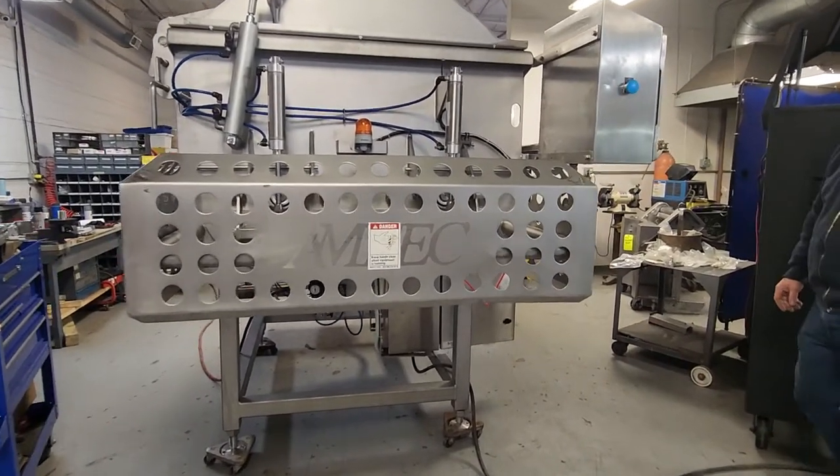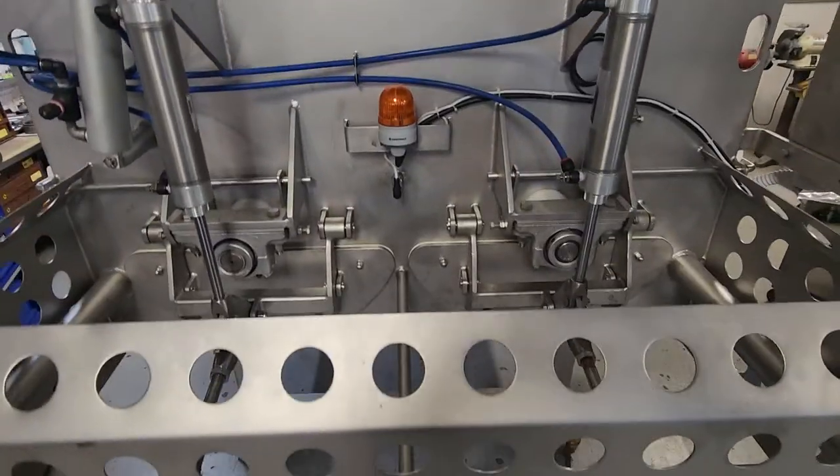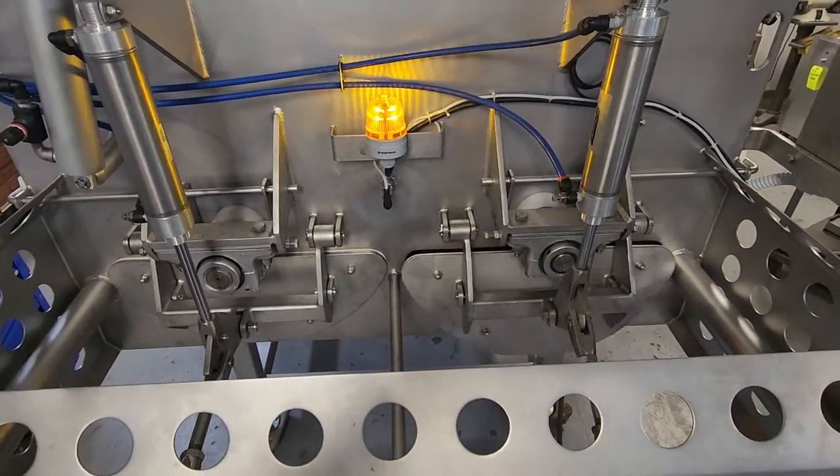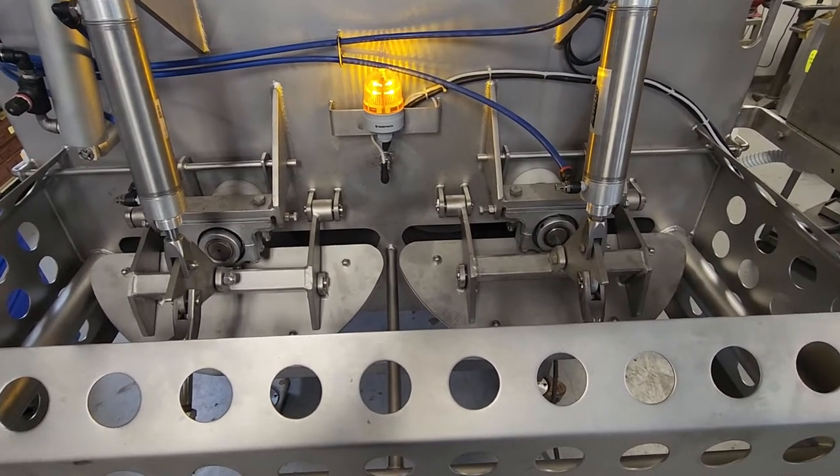Amfec blender testing. Let's first open and close the discharge doors. And close.